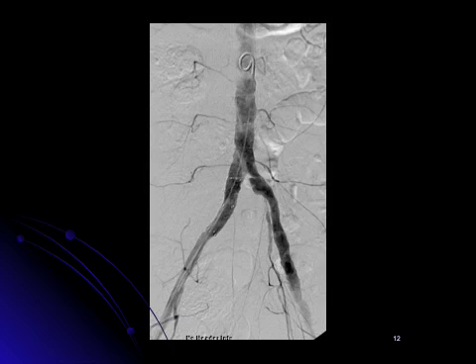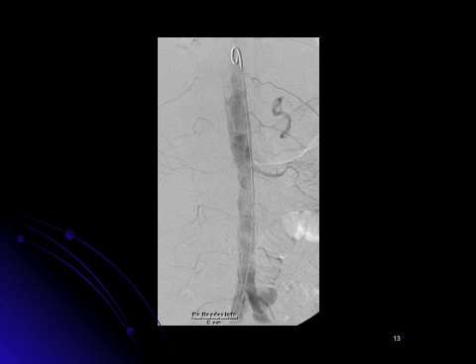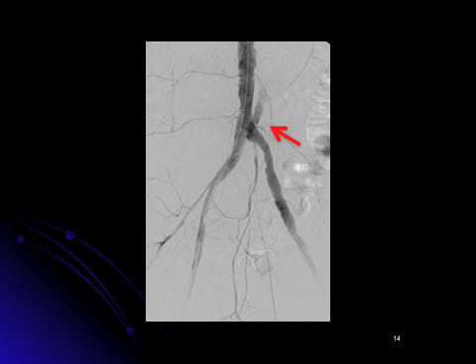We pulled both catheters, provided pressure for approximately 10 minutes, and then the patient was about to be moved off of the table when he complained of abdominal pain. His blood pressure suddenly plummeted, and we repunctured both the right and the left side. Midstream abdominal aortogram was obtained. You can see that the renal arteries have shut down. There is extravasation noted from the right common iliac angioplasty and stent area, and the vessels are all quite small.